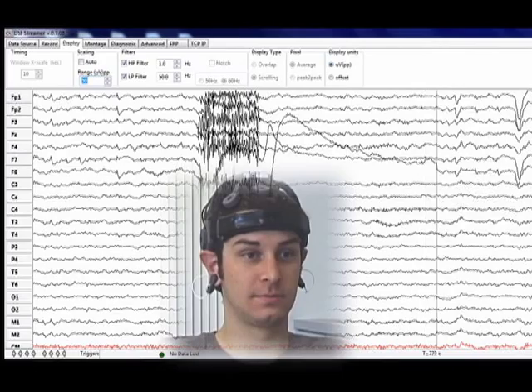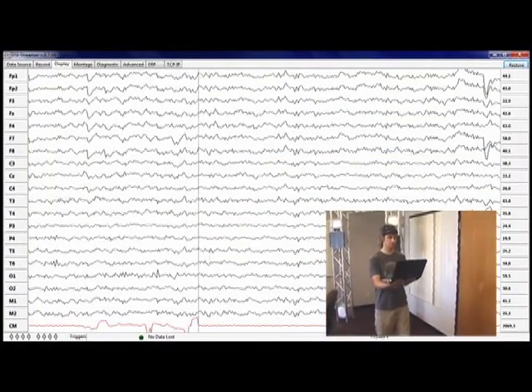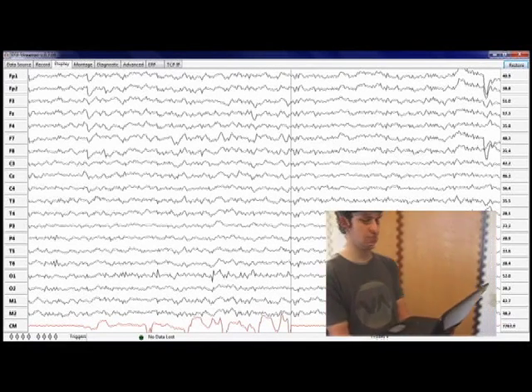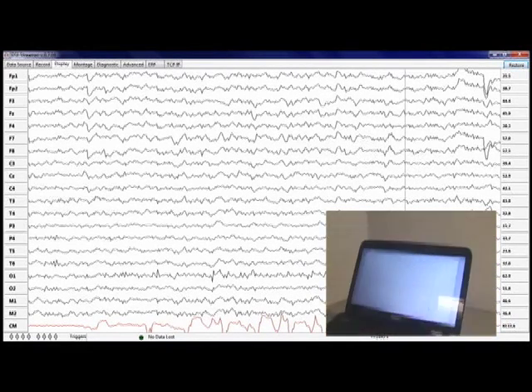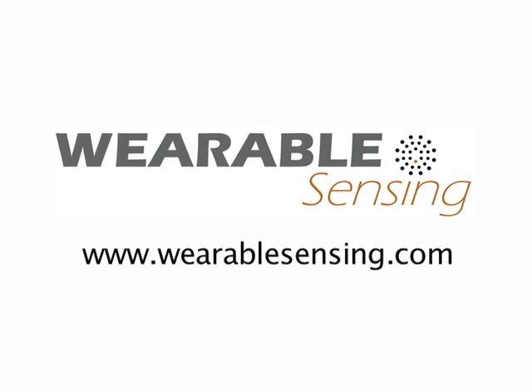And finally, here is EEG activity while the subject is walking, using only 1 to 40 Hz filtering on the signal. Wearable Sensing is bringing high-quality wearable sensors to meet your research needs. Please visit our website at wearablesensing.com for more information.